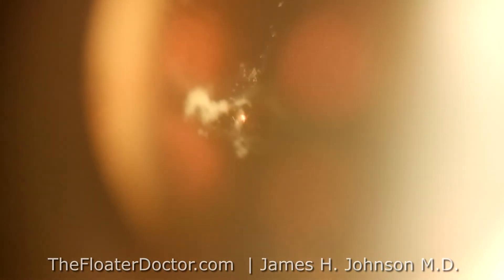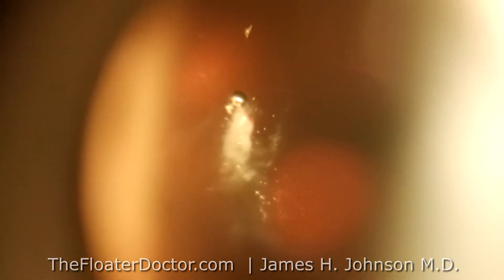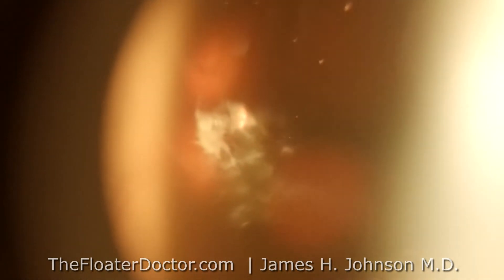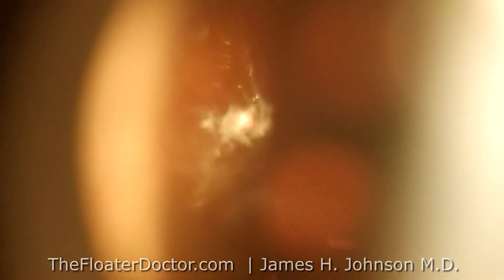Changing the energy setting — you can see it's starting to break up and change. The laser does tend to push things back a little bit. We're nowhere near the retina, so we're in a very nice safe zone to treat. At some point I'll have David move his eye and jog that back into better position, because the energy is always going to be better towards me, closer to the front. As I fire, you'll see these little bubbles quickly move upwards — that is the laser vaporizing, sublimating the solids into gases.